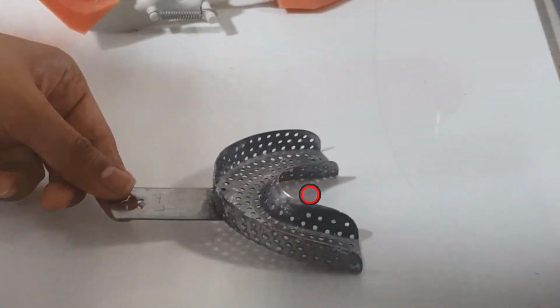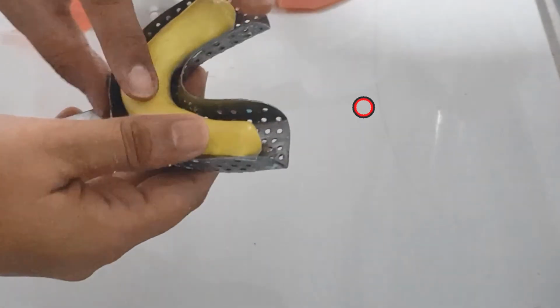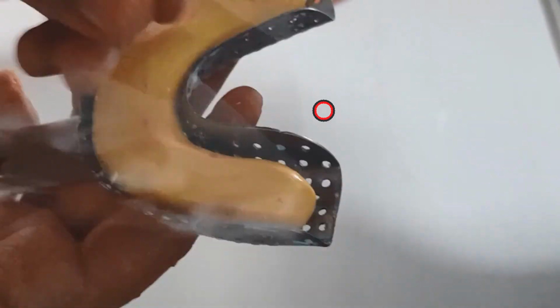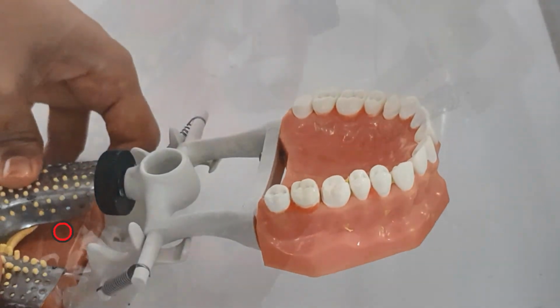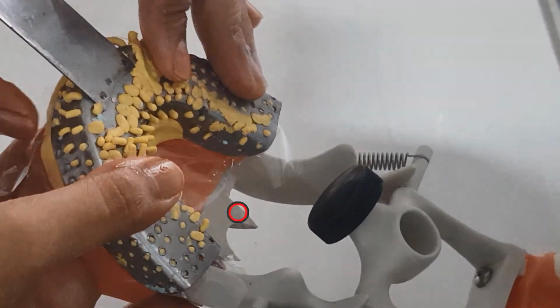So here we can see a quick demonstration. We have a tray, we are taking the putty, we are checking if we are taking enough material, okay. And then we are taking the catalyst, we are mixing it well so that there are no streaks, okay. We have mixed it, we roll it, then we'll place it onto the tray, okay. We'll place a cellophane sheet. Because of time I could not cut it. In fact, we should cut it according to the shape of the arch, and then we will make the impression. When this will set, we will take it out, we will remove this cellophane sheet. We'll get a lot of space and then we'll inject the light body and make the impression again. So that is a two-step with spacer.